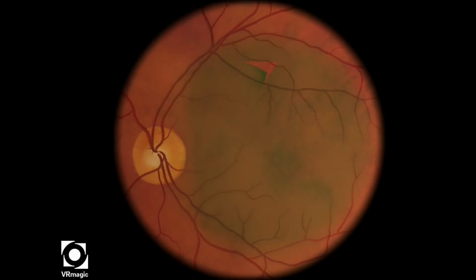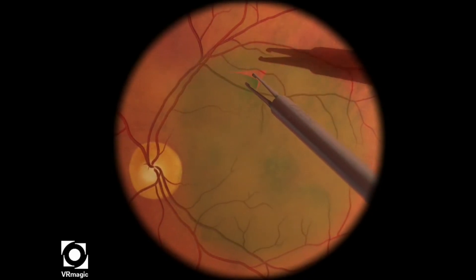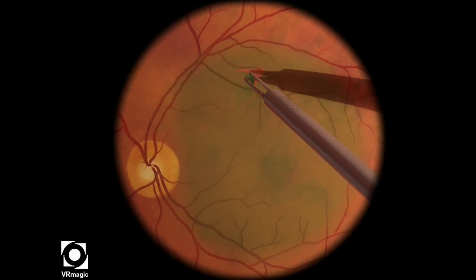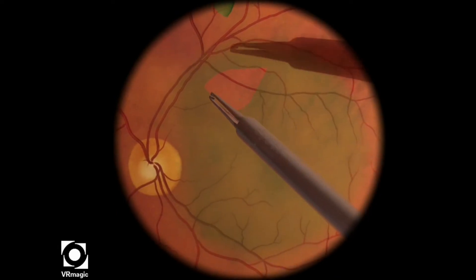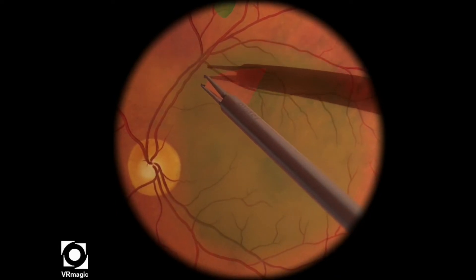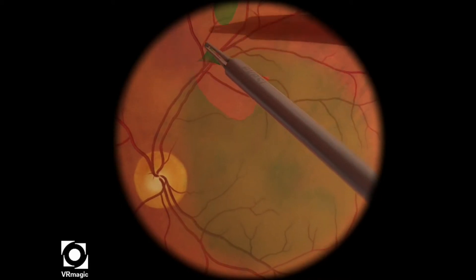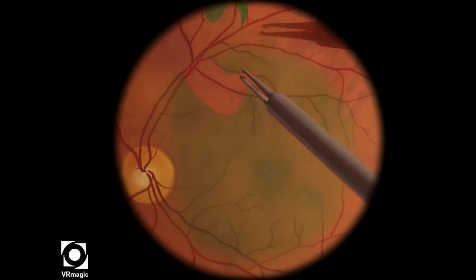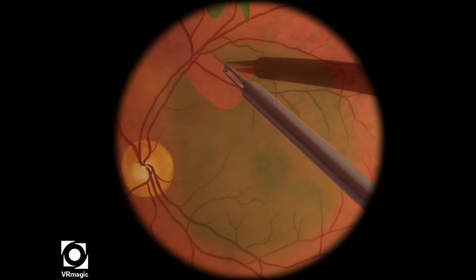In this particular level, your job is to complete the ILM peel. They've started the peel already for you. What I'm doing here is trying to grab as big a piece as I can and expand the peel as much as possible, regrasping as few times as possible.